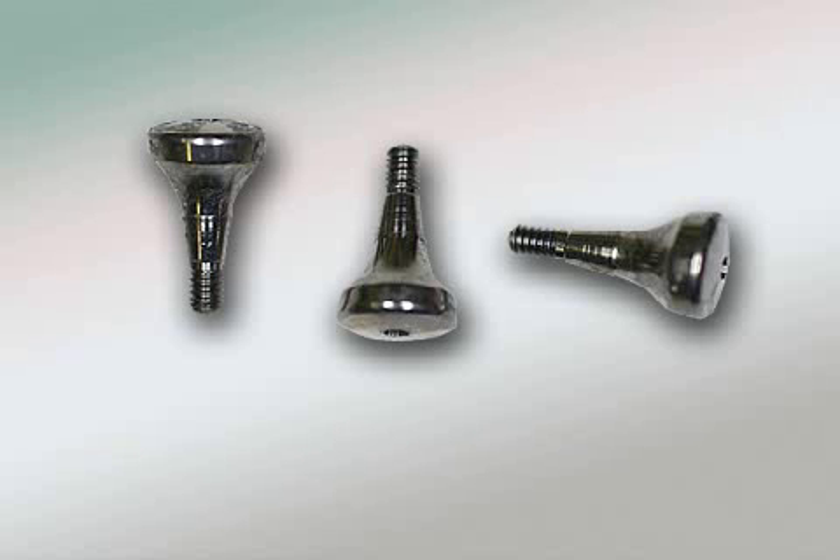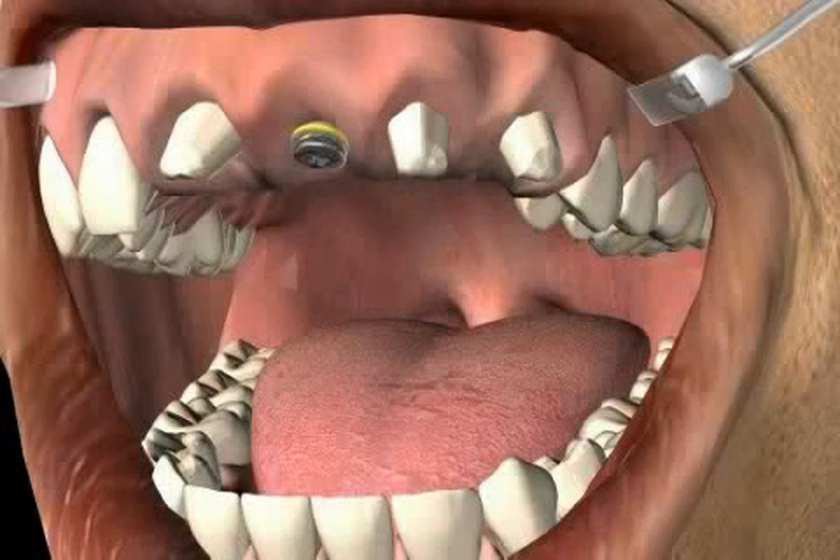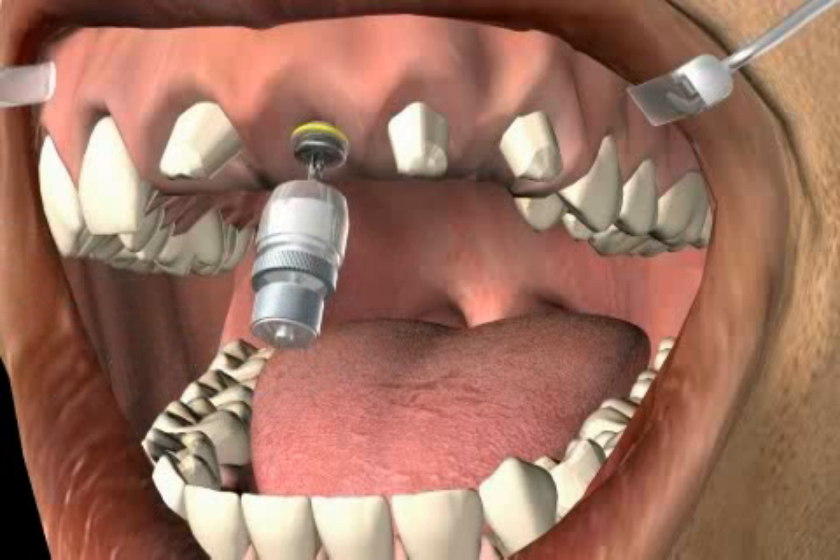The gingiva former or gum former assists in shaping the gums during the healing process after a successful implantation. Here you see a patient who will receive completely new frontal teeth in the upper jaw. Because of a frontal tooth gap, an implant was set eight weeks ago.